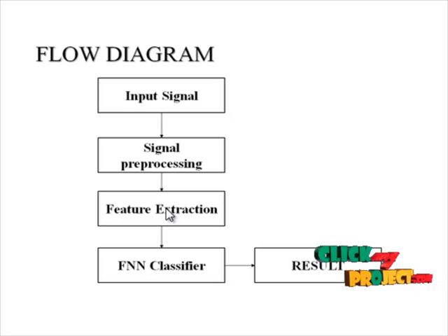It is usually the central and most visually obvious part of the tracing. It corresponds to the depolarization of the right and left ventricles of the human heart. In adults, it normally lasts 0.06 to 0.1 seconds. In children and during physical activity, it may be shorter.